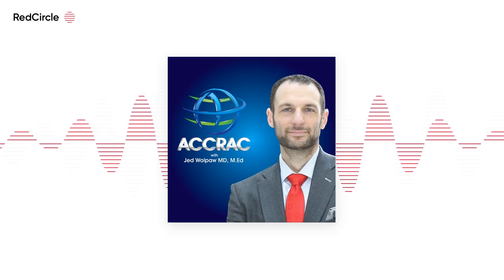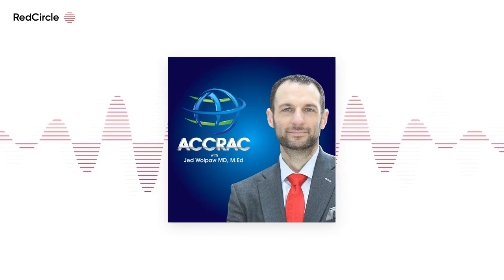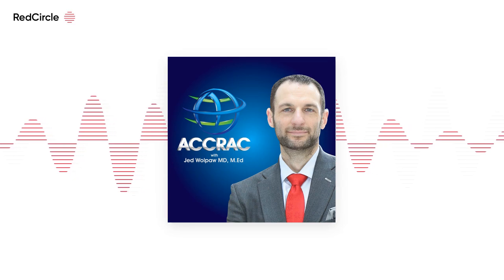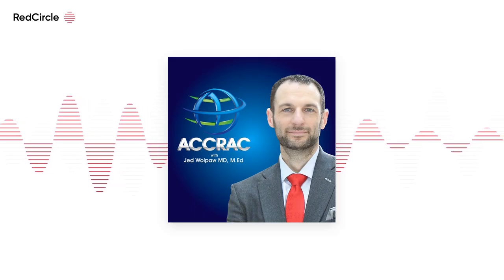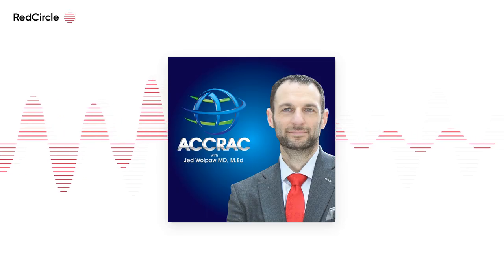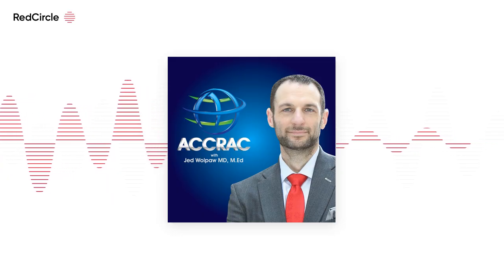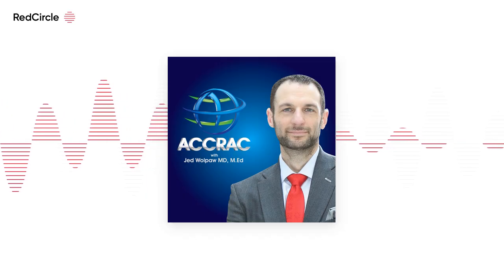Then once you get too low, whether you have derecruitment or airway closure starting to occur, either way, your driving pressure changes because there's now an inflection or a bend in that pressure volume curve. Same when you're going up, your driving pressure all of a sudden goes up because it's harder to get the volume in. So there's a change in your pressure volume curve. It is very common to have several PEEP steps, not many because you're going by two, you might have two or three that are almost identical.